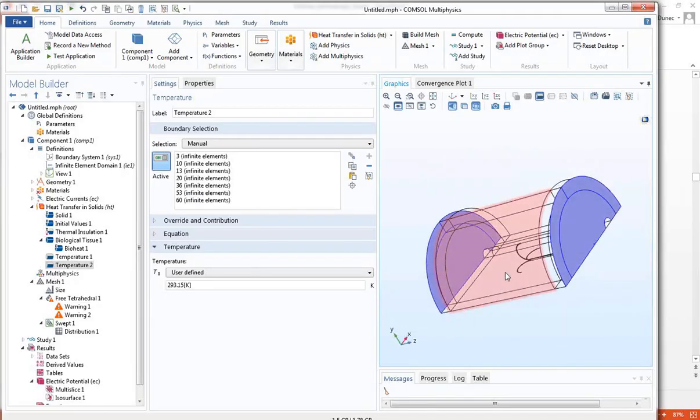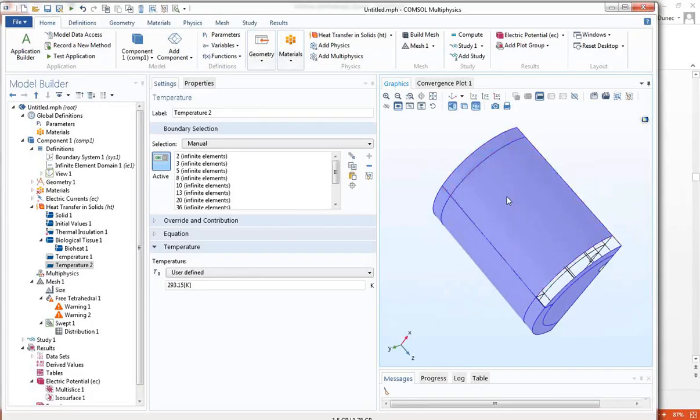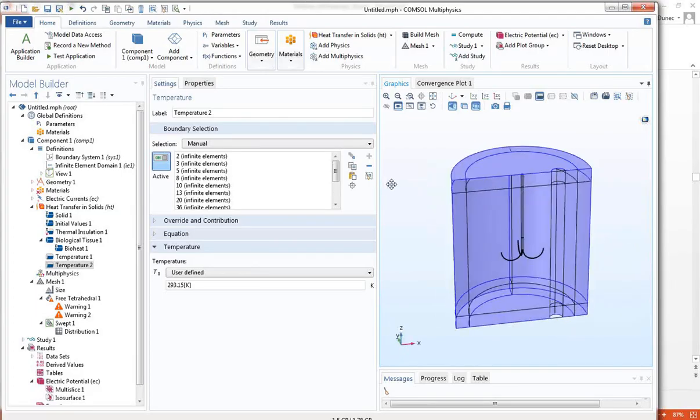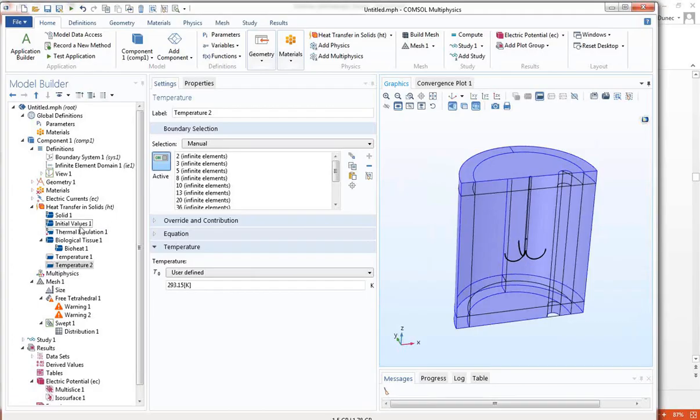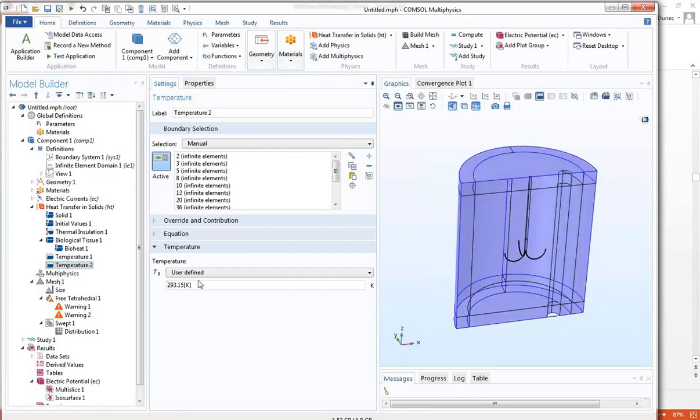And then I'll just very carefully pick these outer boundaries right here. These are all going down to T blood as we're going out to the outer edge. Okay. We're now set. The only other thing I need to do, let me make sure that for once I didn't. Oh, that's right. I didn't set it at T blood. So let's change it to T blood. T underscore blood. This is again what makes this interface so nice. It's so easy to check these things.